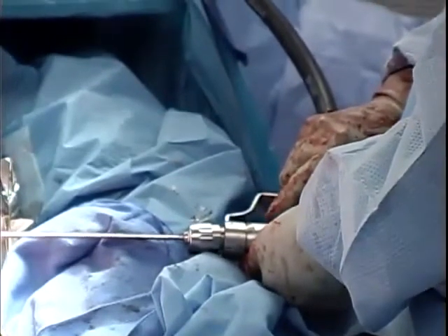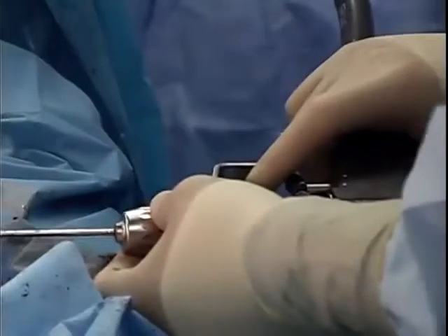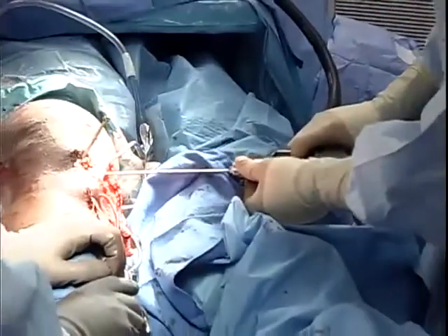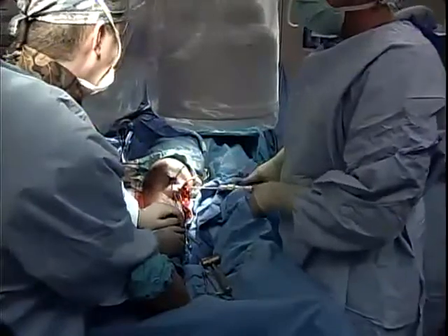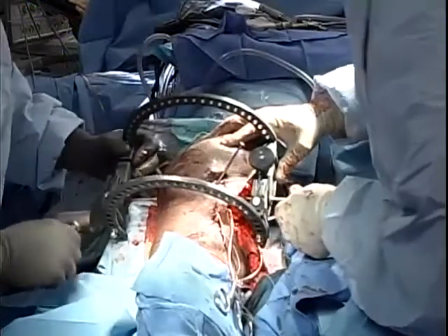Now drive the wire across using the pin driver in a straight line. No further lateral views are taken after this — carefully drive it across, then obtain an AP view with fluoroscopy. On the first AP view, the wire should be parallel to the joint. If it's not, pull it out and start over.